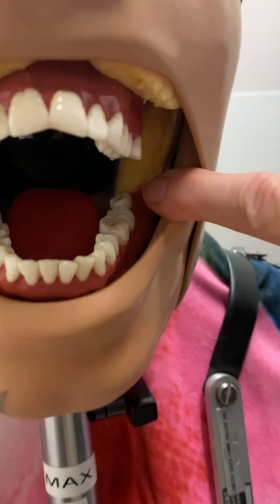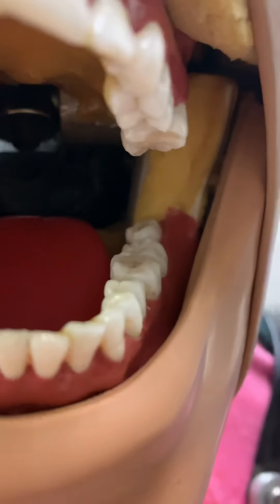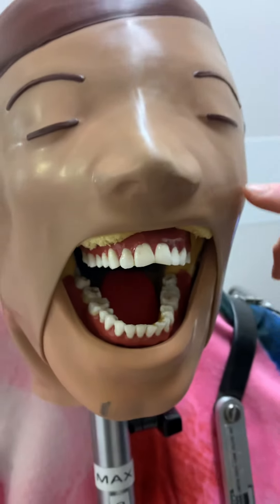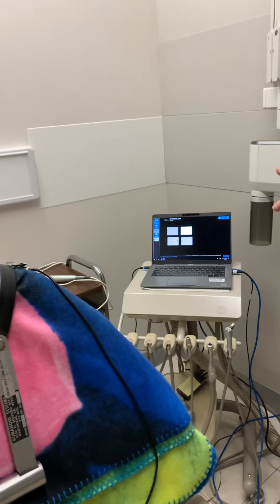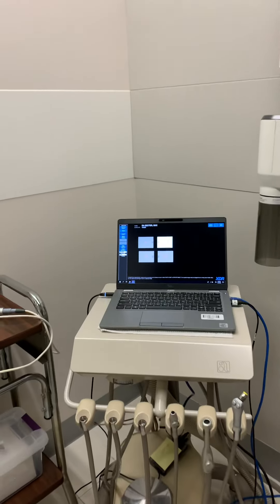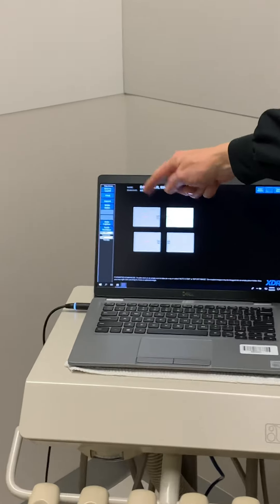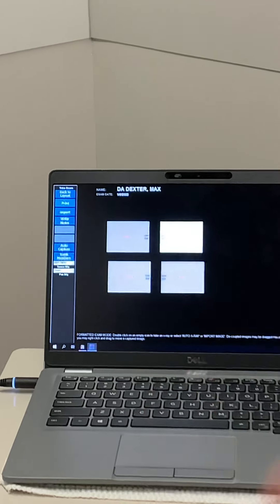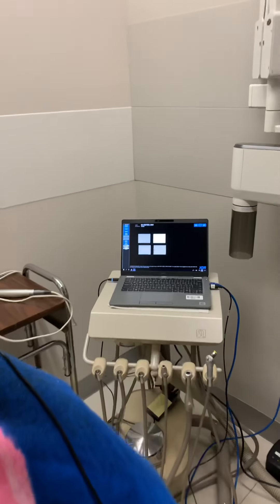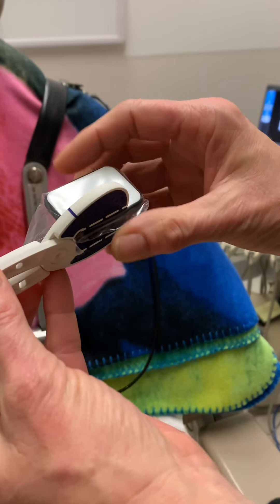We've got tooth 17 here. We're first going to be working on tooth number 16 since we've got the two over here. This is our layout on the computer — we've got maxillary right, maxillary left, mandibular left, and mandibular right. This is our snap array here for the sensor.